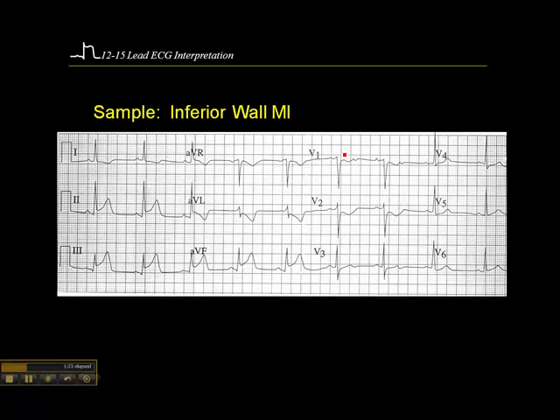In V1, we have a little bit of ST depression. If you'll recall from one of the earlier presentations, when you see an inferior wall MI with ST depression in V1 and V2, that suggests there may be a posterior wall infarction as well.